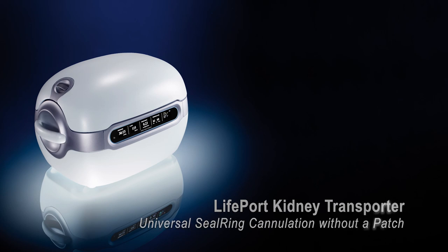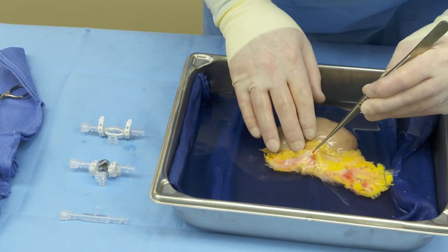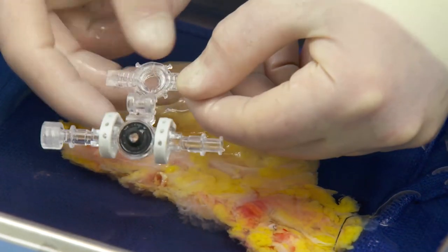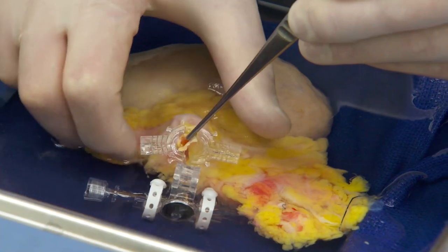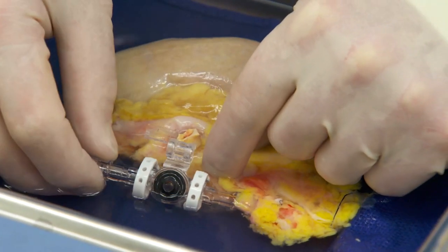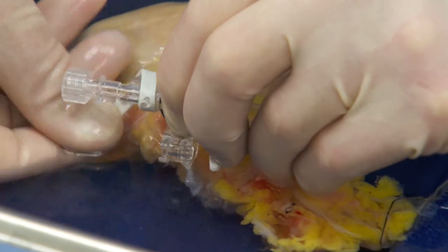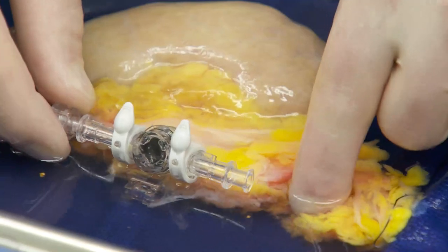Cannulating the kidney using a Universal Seal Ring Cannula without a patch. There are a couple of options for cannulas when there is no patch present, and the least dramatic is the Universal Seal Ring. First, ensure that you select the appropriate size cannula for your vessel. Then open the cannula by unhooking the straps, then unsnapping and opening the anvil. Position the vessel in the center of the anvil so that the terminal end of the vessel is one and a half to two millimeters above the surface of the anvil. Close the anvil around the vessel, then close the upper portion of the cannula, carefully bringing the conical seal into the interior of the vessel. Wrap each strap around the anvils and secure them on the posts. Look through the sight glass to ensure that there are no occlusions.